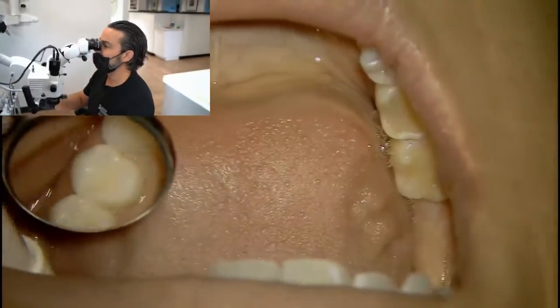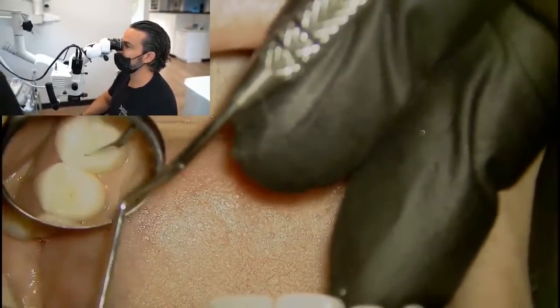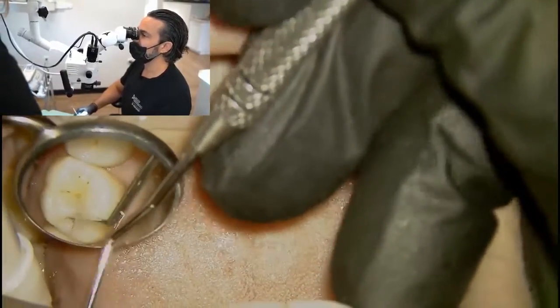So I'm just gently, as you watch me, looking around the mouth, identifying some problem areas.